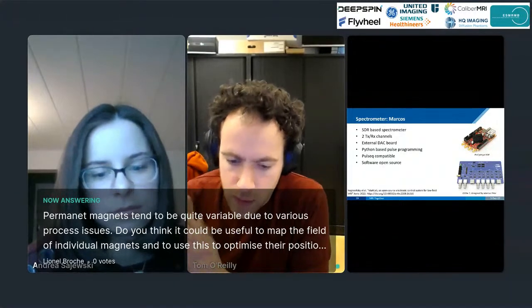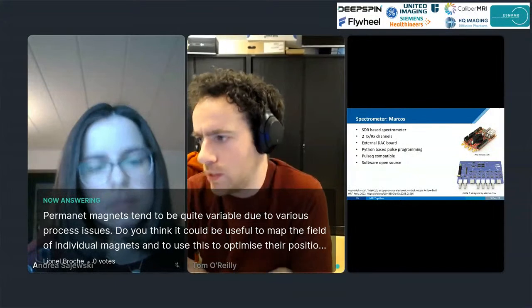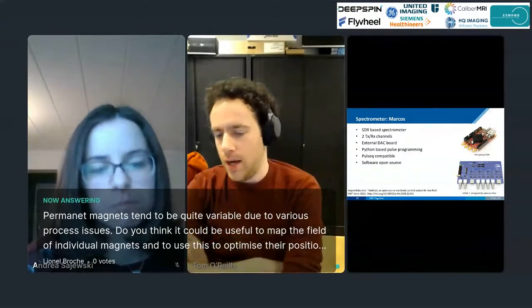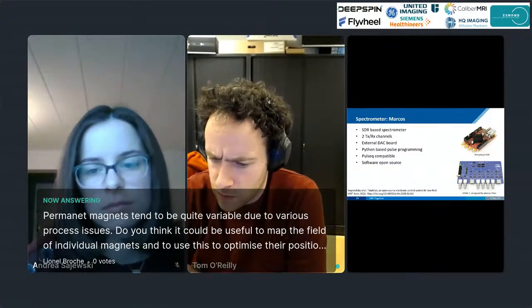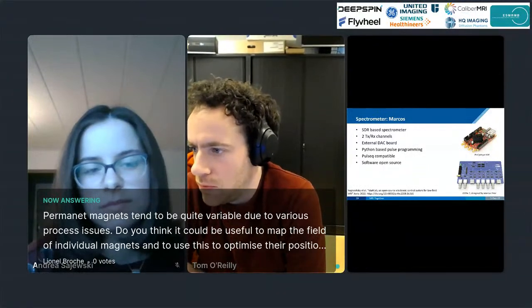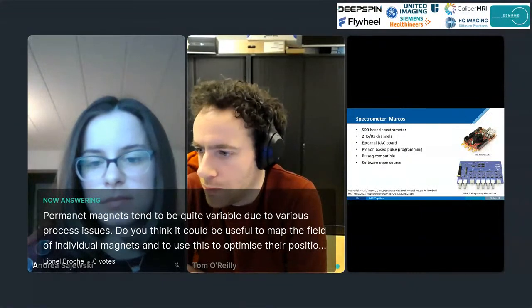Yes. I don't know what the actual number is that you can get from a batch, but the way they do it is they just make a giant plate of material and they cut your magnets to size. I believe we've had 10,000 magnets from a batch, and they didn't bat an eyelid at that. So you can get quite large quantities, although I don't know exactly what that number is.